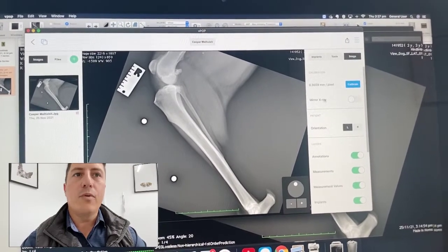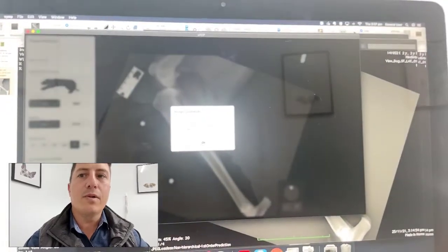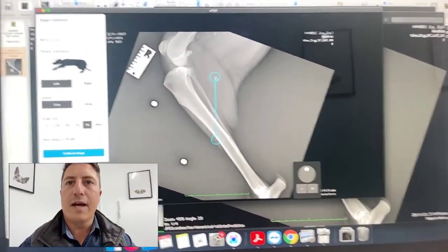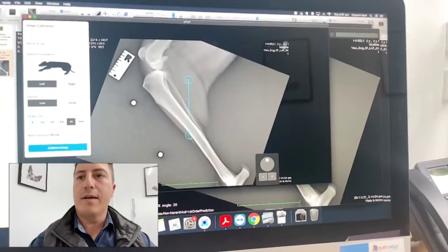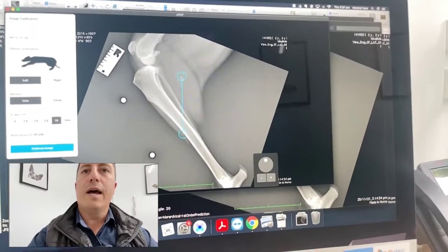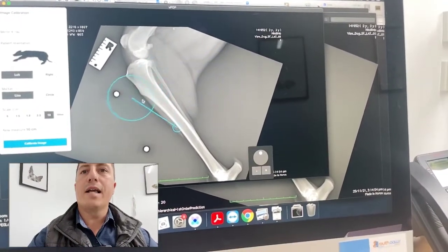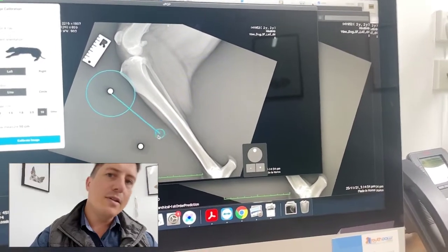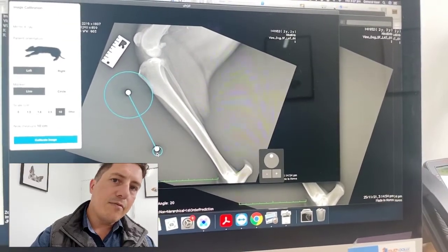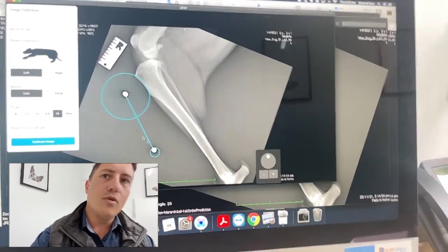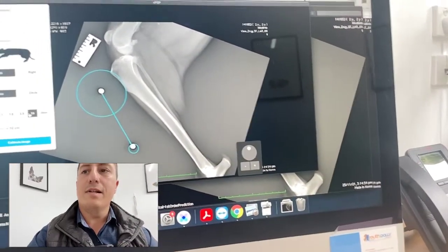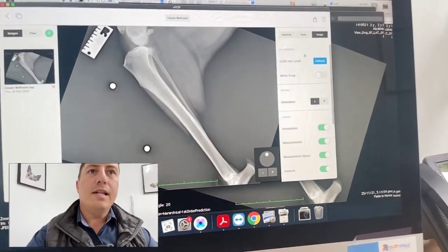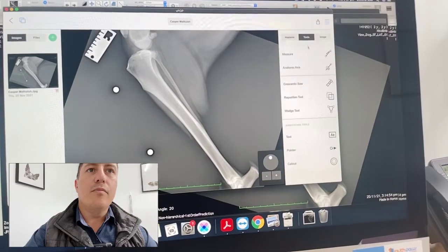Once we've done that, we want to calibrate this image because we're going to be templating and putting implants on here. To calibrate the image, we bring our calibration tool down onto our radiographic markers, going from the bottom of one ball to the bottom of the other. I know that distance is 10 centimeters, so you select 10 here, hit calibrate image, and now that image is calibrated.